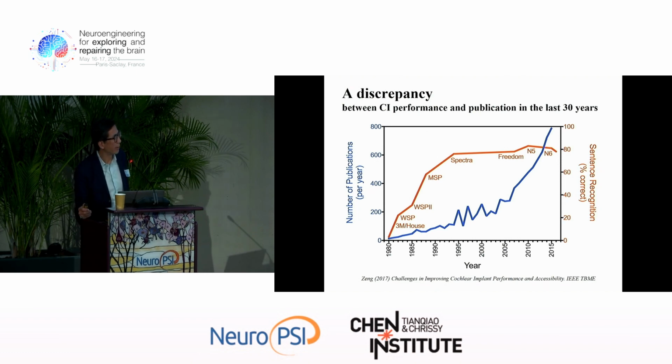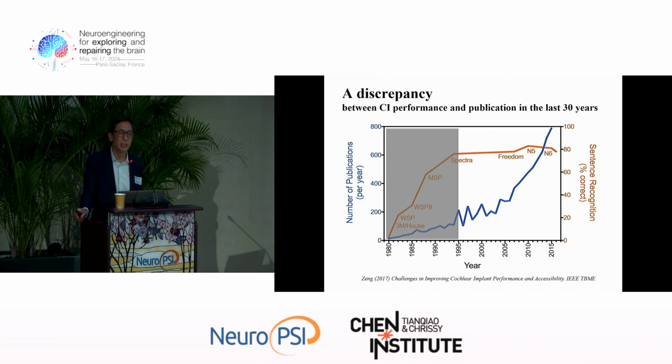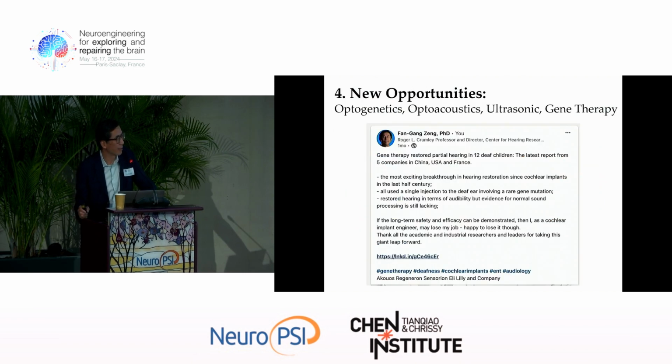But you look at the quality, right, the performance. After 1995, we have not improved cochlear implant performance. And that's why Bryce and Anton are trying to do that cortical stimulation. I said, yes, please do, right? But I also had the chance to talk with Sergio Picco yesterday. There's a different approach to address this lack of spatial resolution problem in the neural-machine interface.